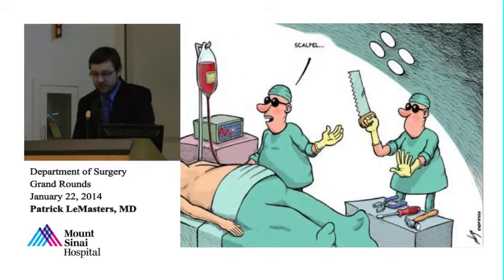So basically, with the evidence supporting the fact that ultrasound is superior to the landmark method, it rests with us to practice evidence-based techniques and perform our vascular access with ultrasound. Why would you perform anything blind, basically? And I think this depicts it well here. So now let's move on.